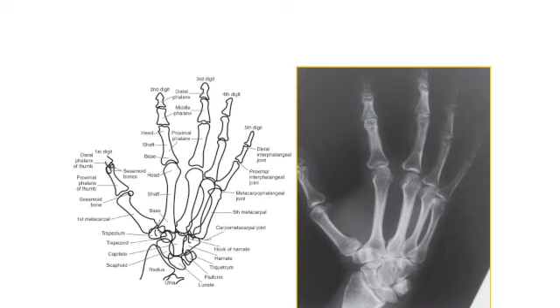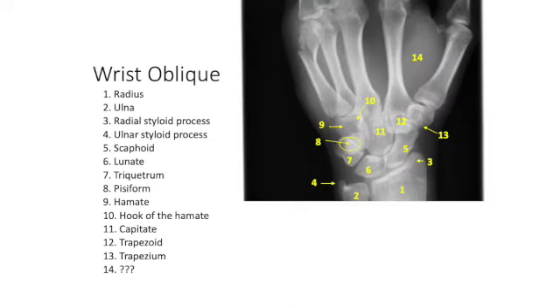So if we can't see something with a PA view, then sometimes we're going to have to use an oblique view as well. Think about your patients that get things like metal stuck in their hands, or a piece of pencil lead, or maybe there's an avulsion fracture and we need to see where that bone is. Sometimes this oblique view can just give you enough of a tangent that you can really get a good idea for where the structures are.